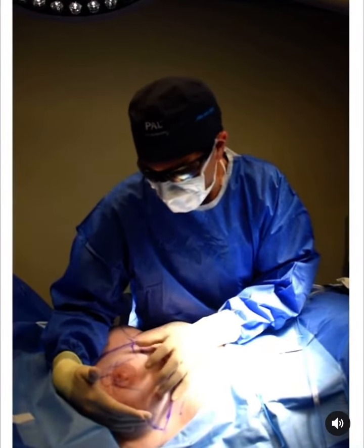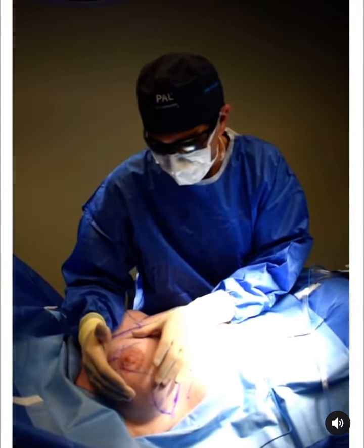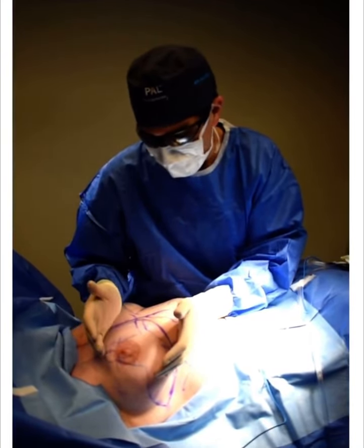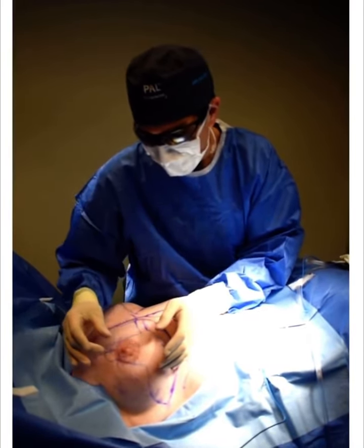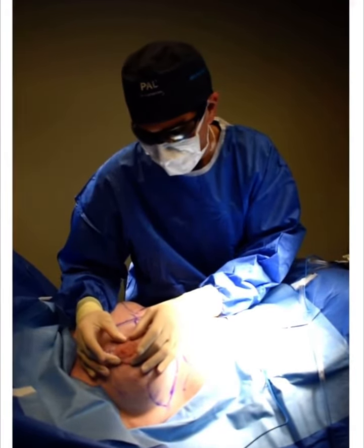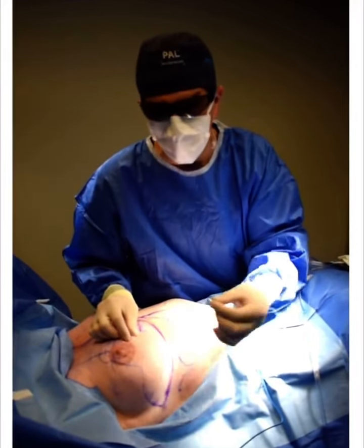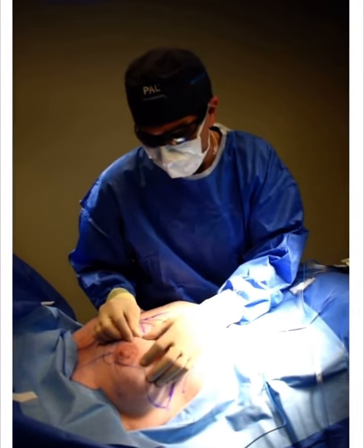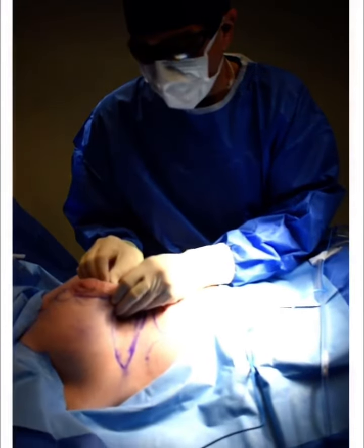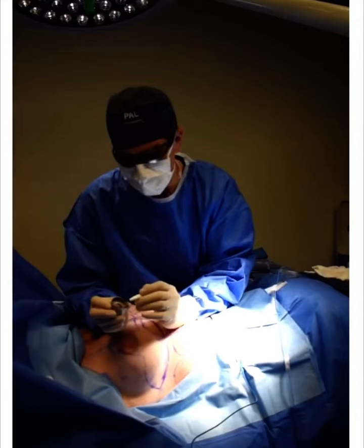What we're going to do with this patient: she wants to have implants that are smaller. At the same time, she wants to have her breast lifted. So we are planning to do a mastopexy, or breast lift, decrease the size of her areola, bring her nipple up, and then take out her implant. The implant she has right now feels a little bit bigger, so we have to re-drape the breast tissue and skin over the new implant.